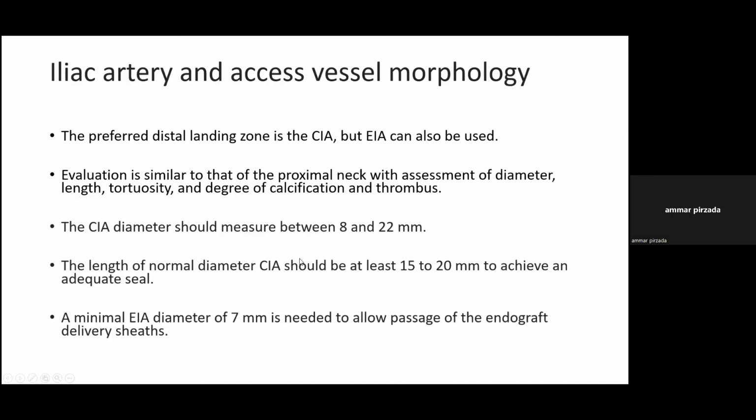The length of the normal segment of common iliac artery should be at least 15 to 20 millimeters to have an adequate seal. And if we are to use external iliac artery, a minimum diameter of 7 millimeters is needed to allow the passage of endograft delivery sheaths.